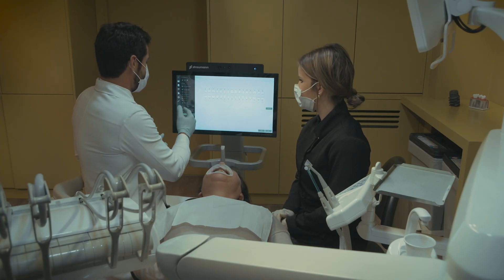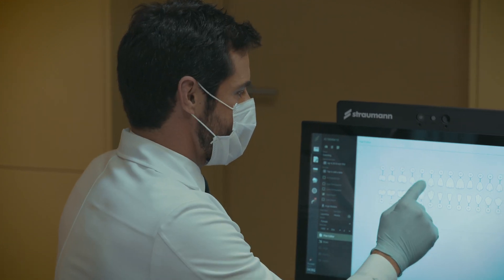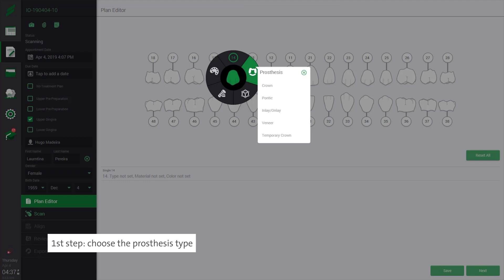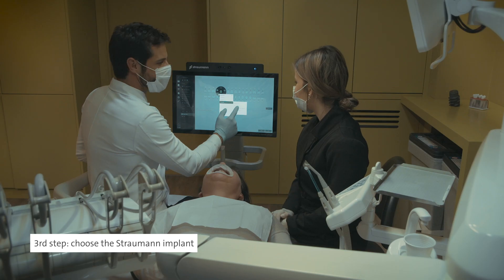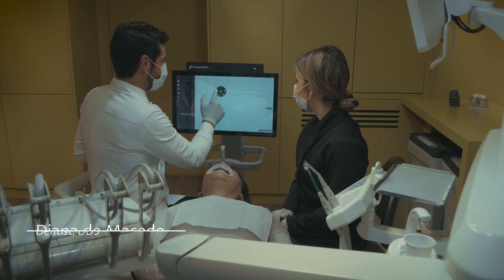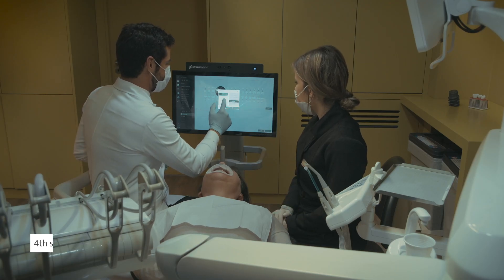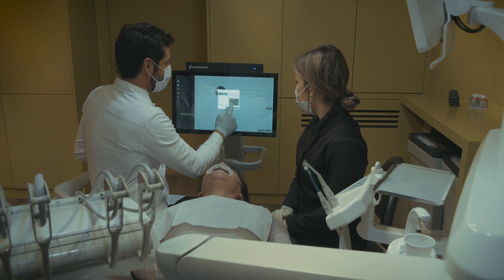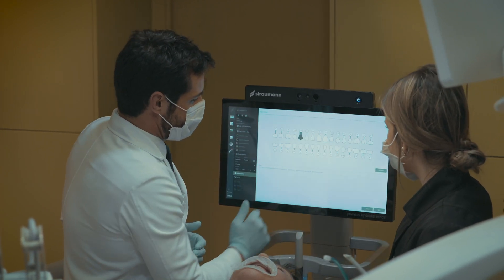Now we will start our intraoral scan. First we choose the option of upper gingiva because we want to have our gingiva profile before scanning the scan body. Then we choose the tooth — in this case it's tooth 14. We choose the prosthesis, which is a final crown, so we'll choose zirconium material. Then we choose our implant — Straumann, BLT, bone level, narrow platform. Then you can choose the collar and the shade. In this case we'll use the VITA scale, A3.